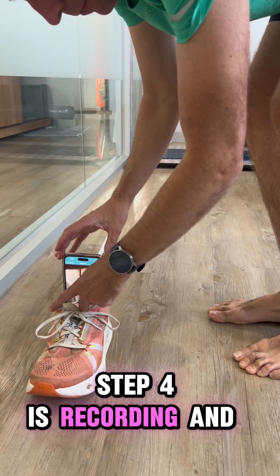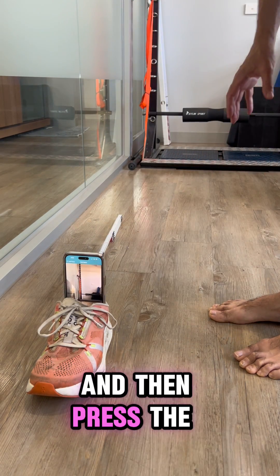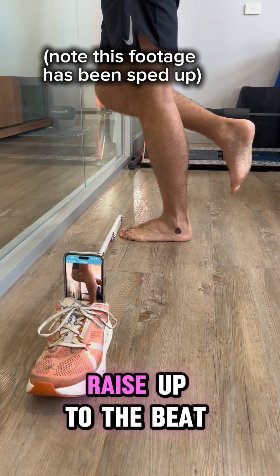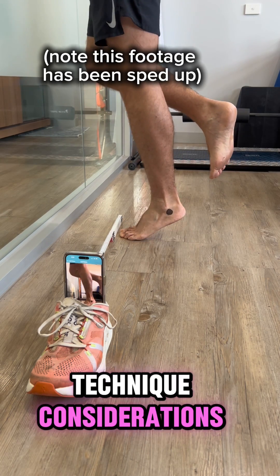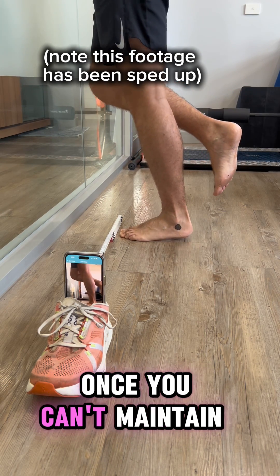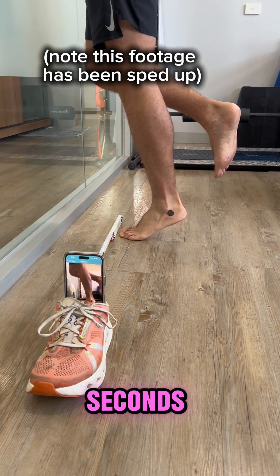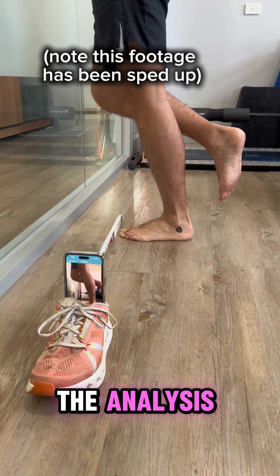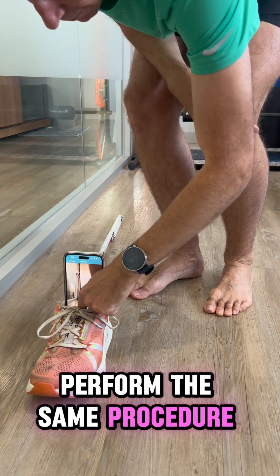Step 4 is recording and performing the test. Once you are ready, press the start button and then press the record button. Walk over to your start position and begin doing the raises. Raise up to the beat and lower to the beat. Perform as many reps as you can, taking into account the technique considerations mentioned before. Once you can't maintain your full height, stop the test, pause in position for 3 seconds, then walk over and press the stop button. Don't worry about performing the analysis, just hit cancel. The video will be saved to your camera roll. Perform the same procedure on the other leg.